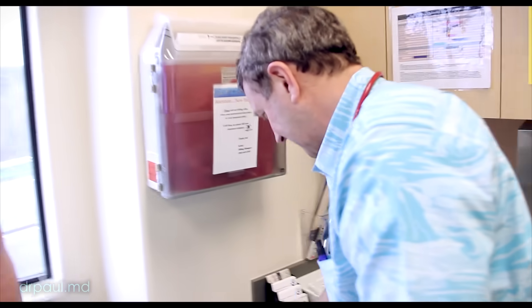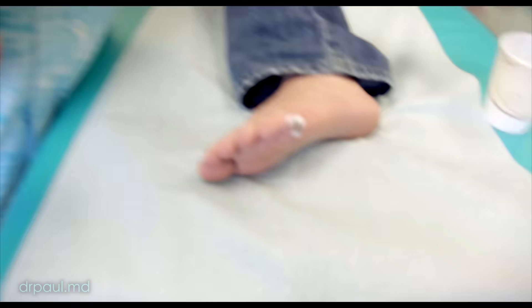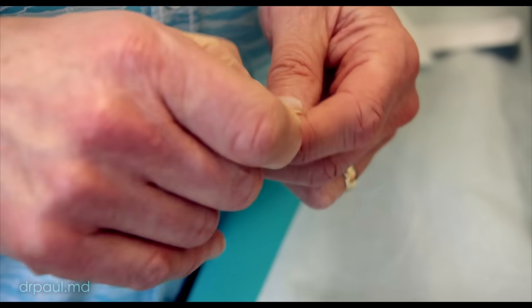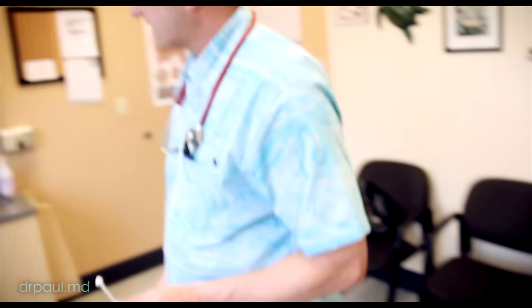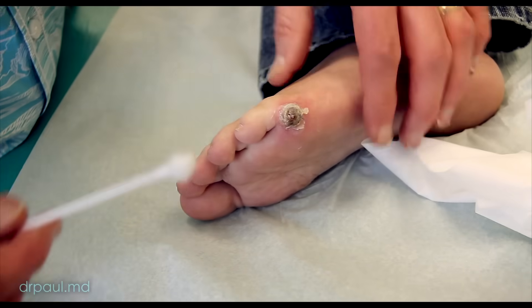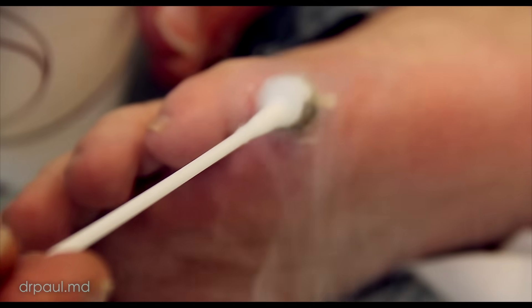I'm going to close the door in case you start screaming too loud. Hopefully it won't hurt too bad. What I do here — if you want to look at this little Q-tip — is I loosen this up because we want to be able to hold enough of the liquid nitrogen in the end of the Q-tip. You kind of loosen that up and then it'll hold a lot more. I'm just going to get a Kleenex — not too high tech here — to wipe off all that numbing cream. It's a little kind of pale around the edges; I don't know if we got it all that frozen. Now the top of your wart is just a big old scab.